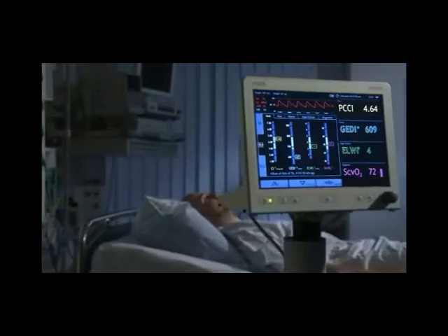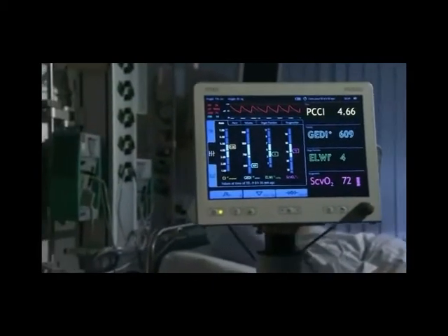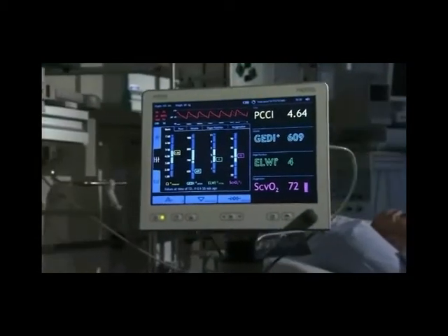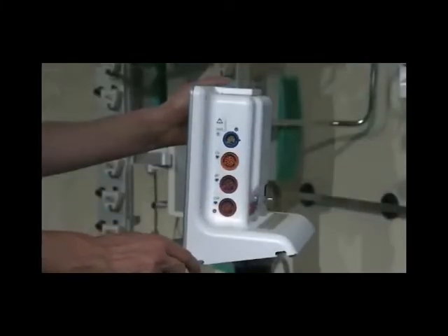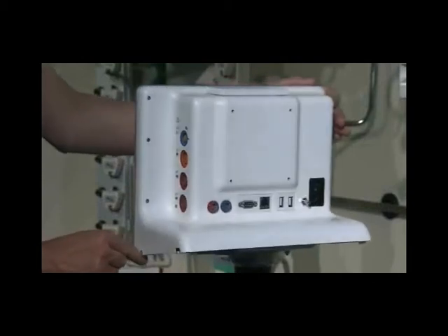The Picco₂ is clearly laid out and user-friendly. In front are the touchscreen, function keys and navigation aids. The cable connections to the patient are at the side, and the mains, power switch and other possible connections at the back.